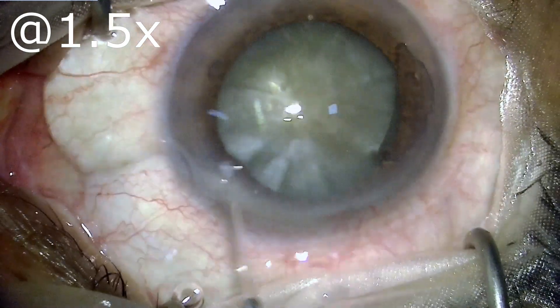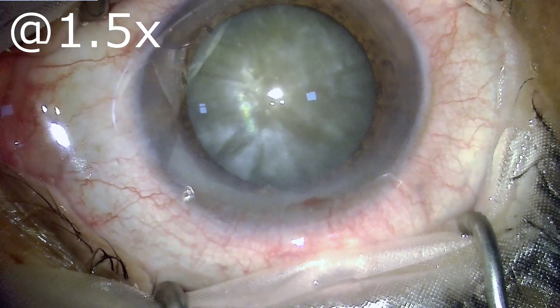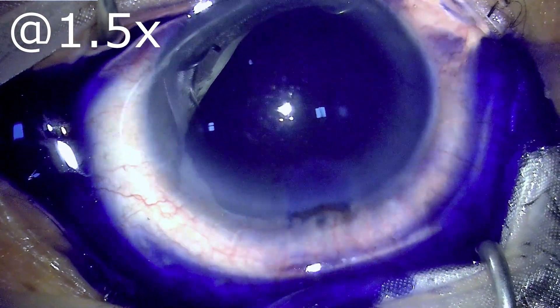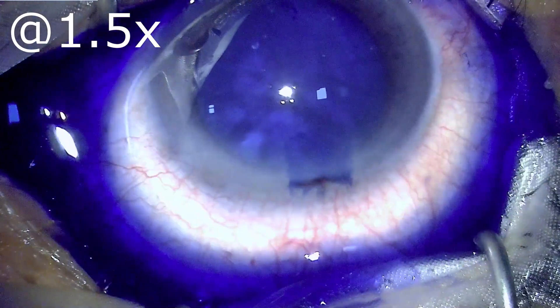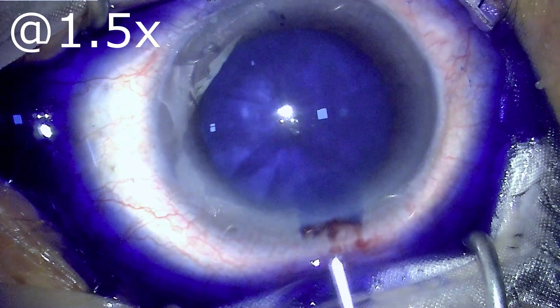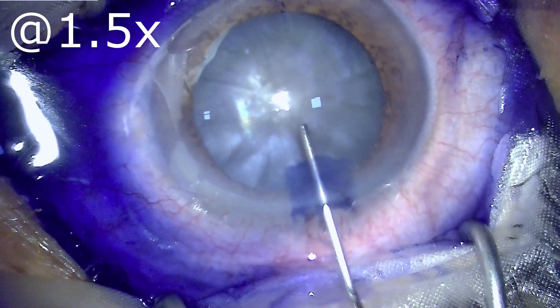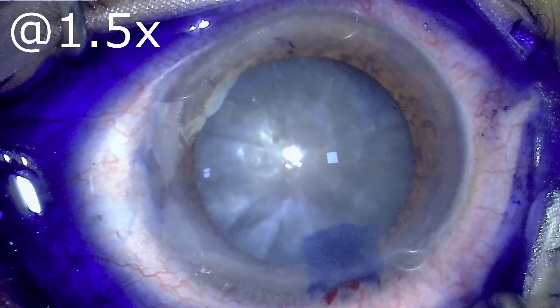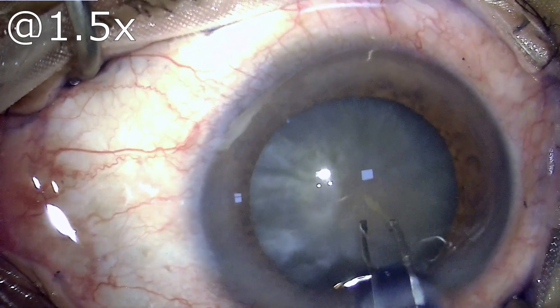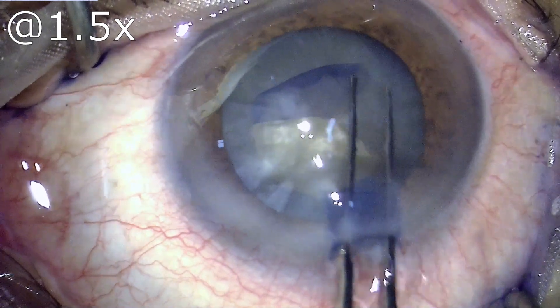Making a clear corneal incision of 2.8 mm, instilling intracameral lignocaine 0.5%, then proceeding to stain the entire capsule using trypan blue dye. It is important that the capsule is stained in these white cataracts because the transparent capsule with the background of an opaque white lens is not visible, so staining it makes the capsule clearly visible.